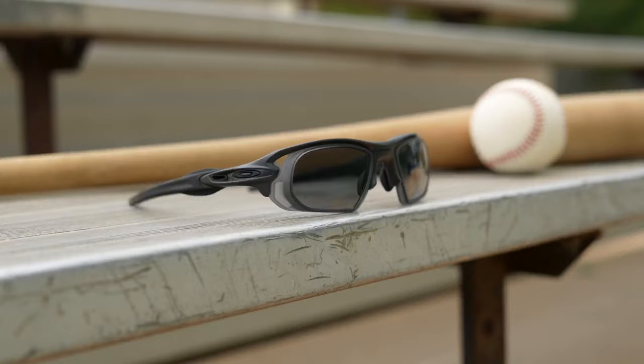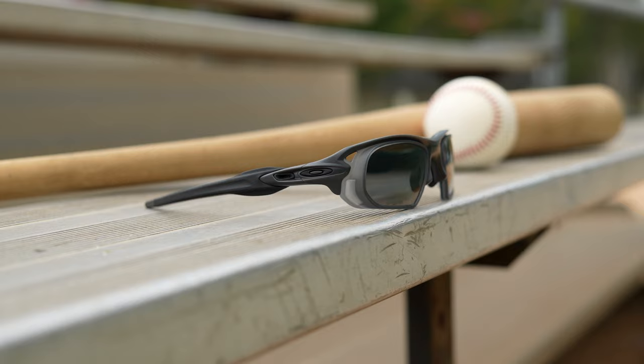We chose a matte translucent gray for the color not only because it blocks additional light entering from the sides of the periphery, but it looks great with our very own matte carbon colorway that we designed in collaboration with Oakley, in addition to the brighter colored eye-catching Flak frames like the one you see here.